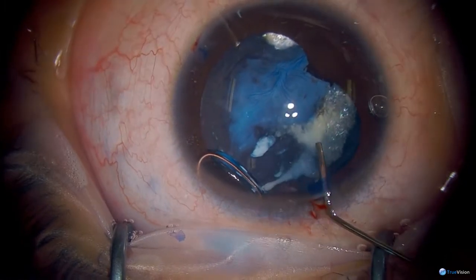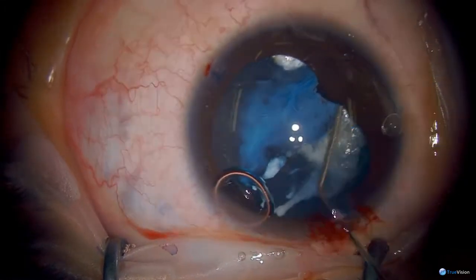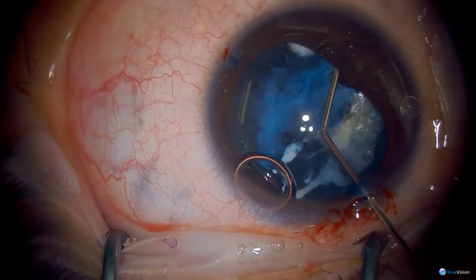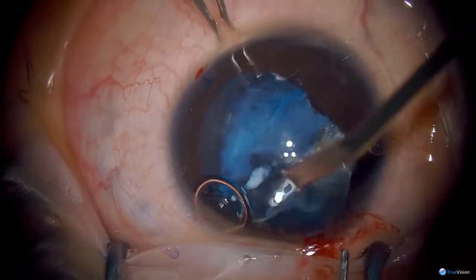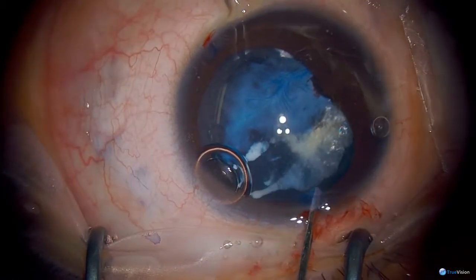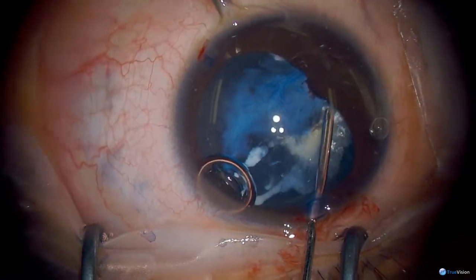And I'm only using two small incisions to make this part easier. I will enlarge the superior wound to put the lens in. So I've just placed a bit of viscoelastic underneath the iris here. And everything else here looks very good.